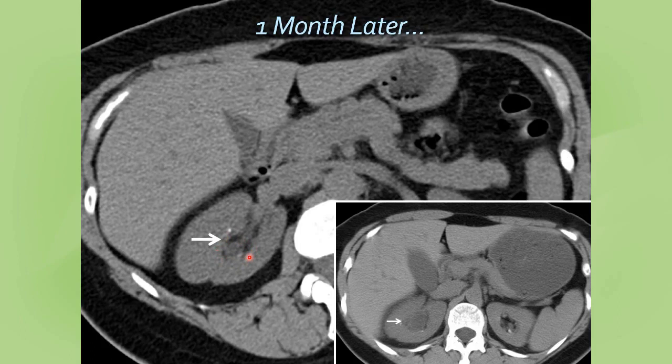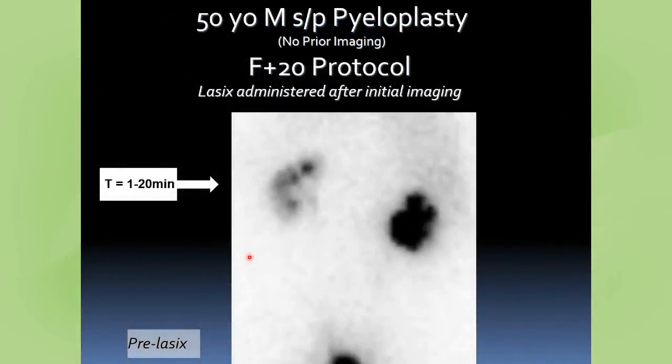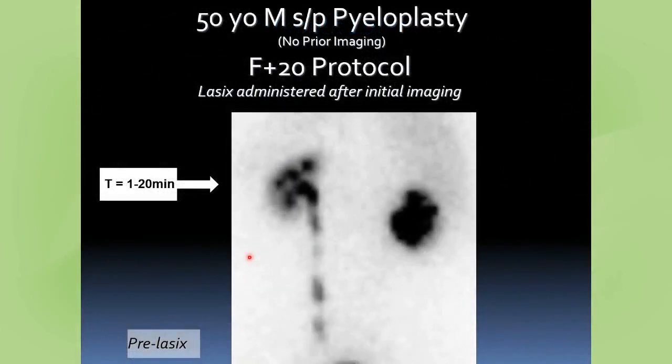So it makes sense. All goes together that this was just kind of a post-obstructive dilatation that resolved before she came to us for assessment. Everything was normal, and this is anatomic finding confirming that. Again, sometimes that's not the case. Now let's talk about a different protocol.